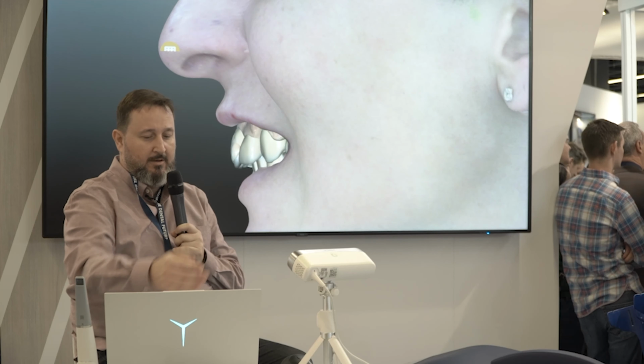Okay, now we go with the treatment. We will perform some crowns. As I told you, she doesn't want any kind of surgery, any kind of orthodontic treatment. So finally we decide to make a little bit of tissue graft. Of course, this is just an image. It is not the real result. And this will be the result. If you look at this, she will be very proud to have this new image.